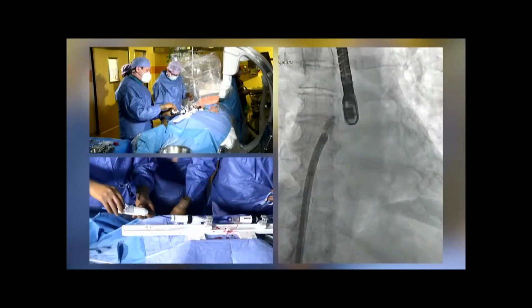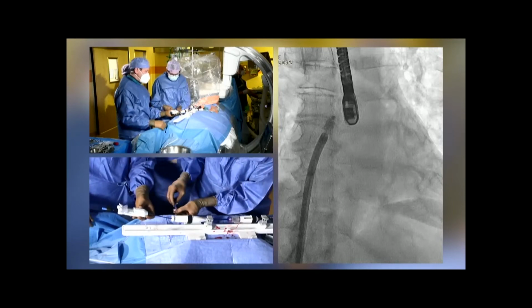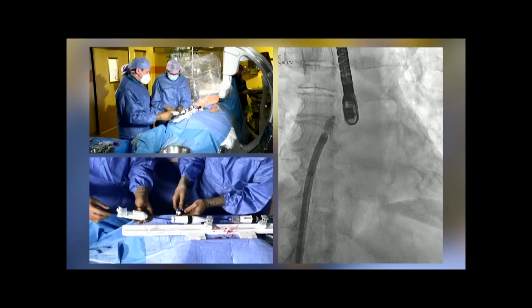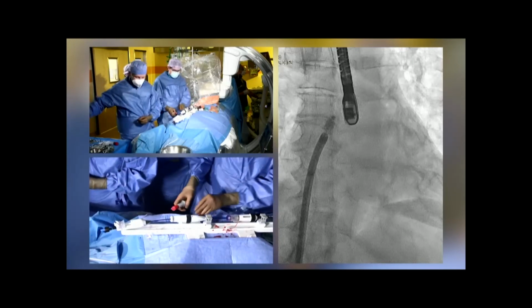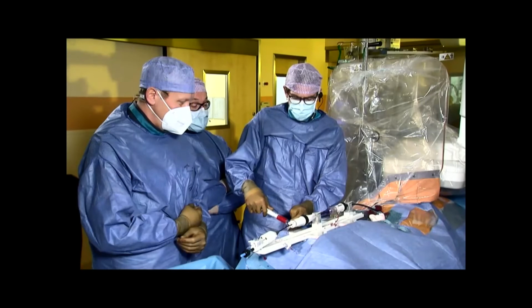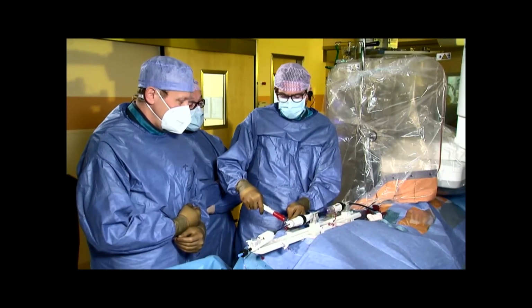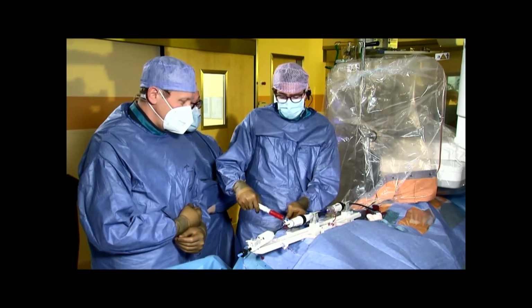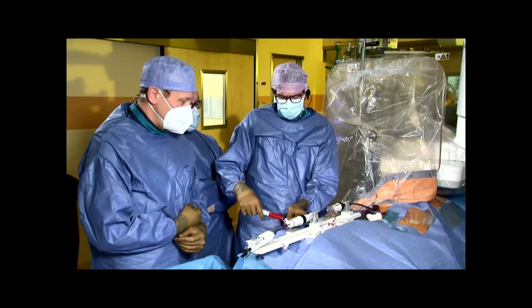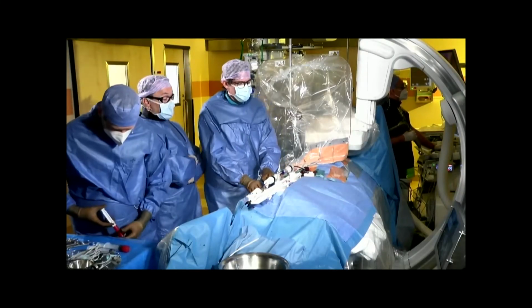Okay, so I think for this case and for most, we should make the most of the opportunity to measure pressures simultaneously. Do you do this on a regular basis? Yes, I really find it helpful. By the way, it's also one of the strongest predictive measures in these procedures, the reduction in left atrial pressures.